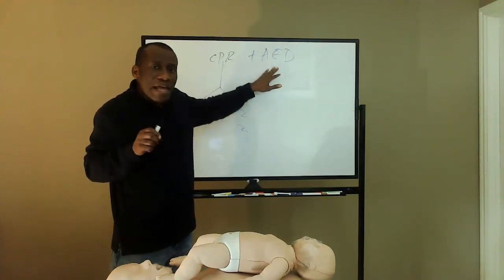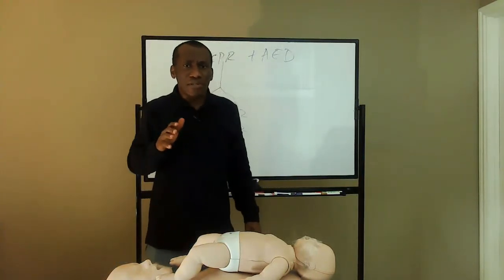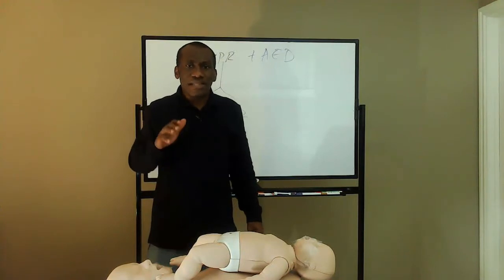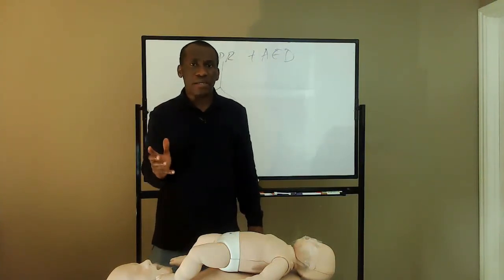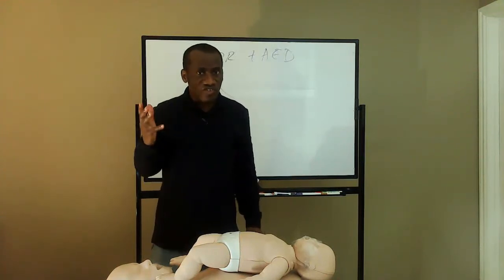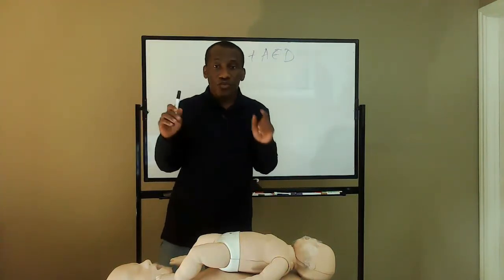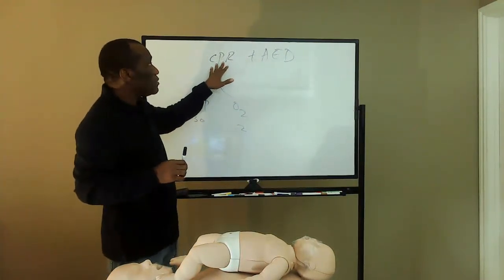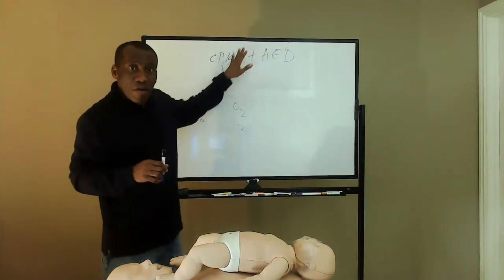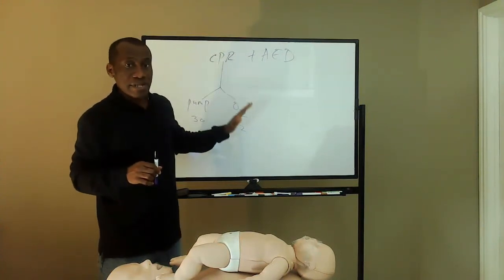That unstable state of the heart, that abnormal heart rhythm that causes the problem, is targeted and corrected through the electrical shock given by the AED. So it is very, very important to note the difference between CPR and AED. Can you combine the two of them? Yes. It is recommended that you combine the two of them.